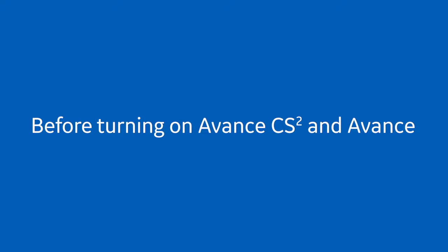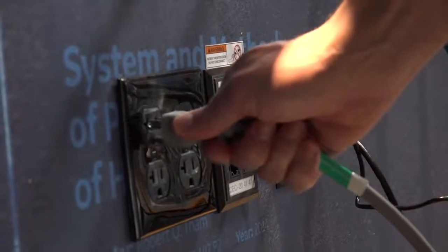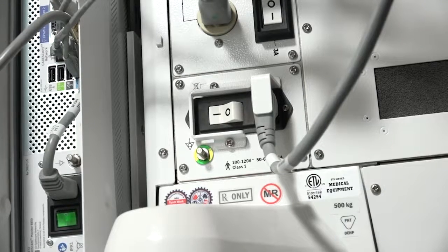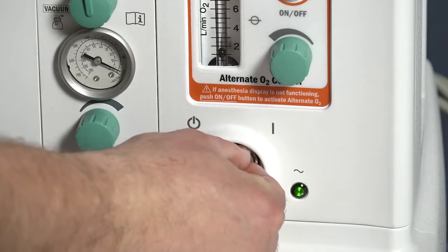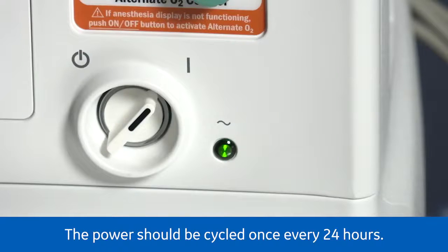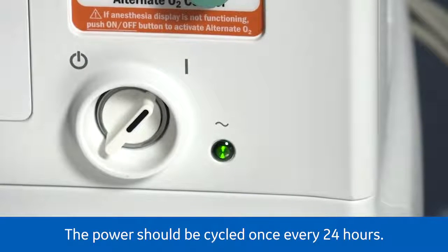For the Avance CS2 and Avance, connect the gas supply hoses to the wall gas source or turn on the gas cylinders. Plug the power cord into an electrical outlet. Make sure the system circuit breaker located in the lower back is switched in the on position. To power the system on, move the switch from left to right to the on position. It will take approximately 45 seconds for the display screen to turn on. The green LED next to the system switch indicates there is AC power going to the system.